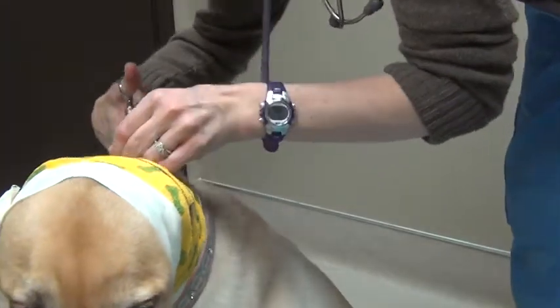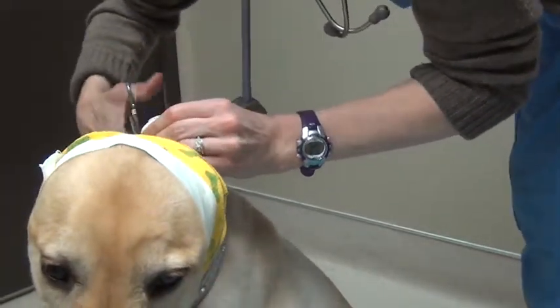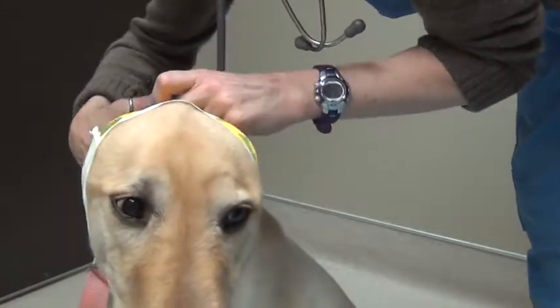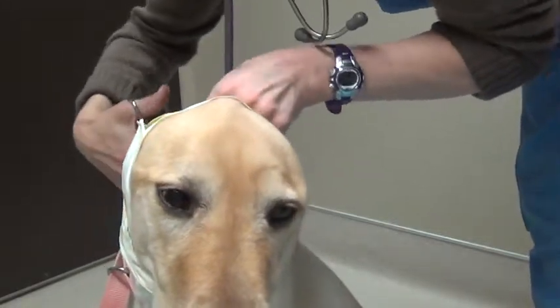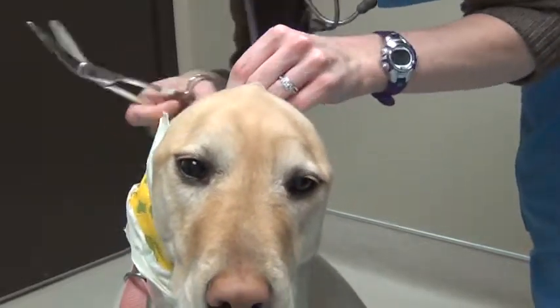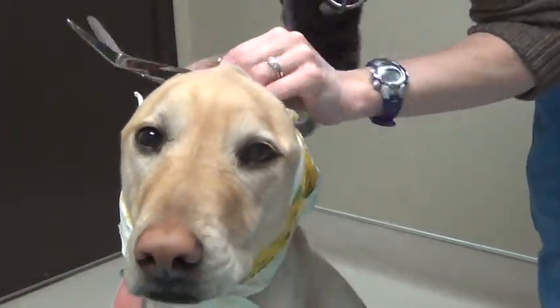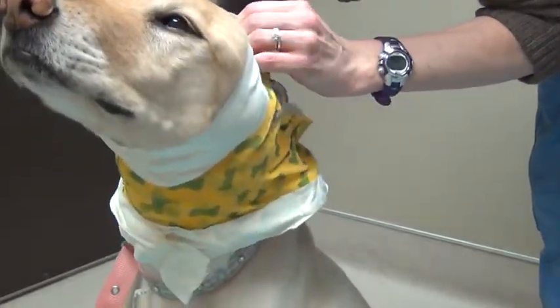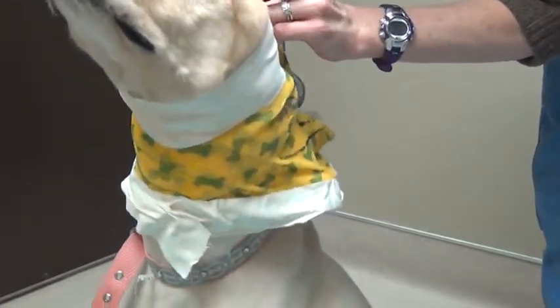Alright, and being very careful. It is much easier to take these off on top of the head than on the bottom. Very, very good girl. See, I can see my other ear. It's popped out now, the hematoma ear. I'm just going to follow the bandage up onto the head.